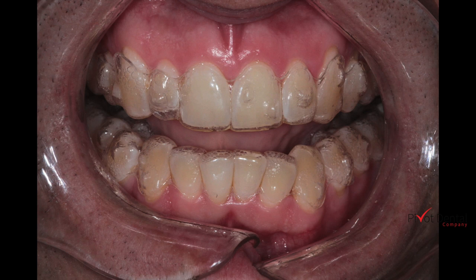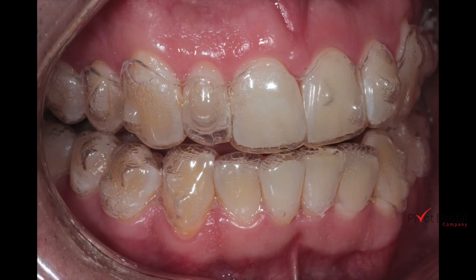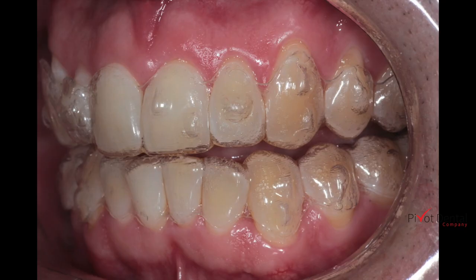You can see with this individual — he has liner number 11 out of 23 in, and everything is fitting fine except for when you look at number 7. You can tell that tooth is not completely seated inside the tray, but number 10, the opposite side, that one is fitting just fine along with all the other teeth.